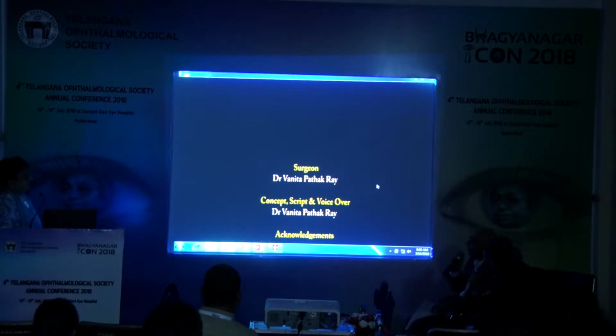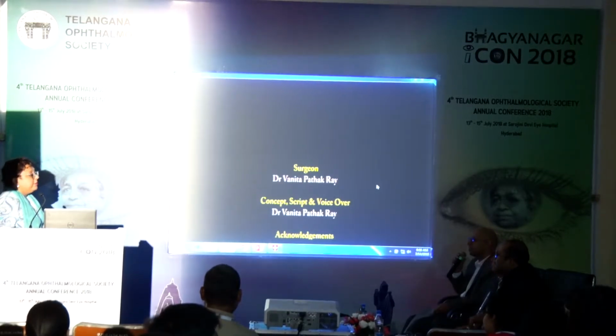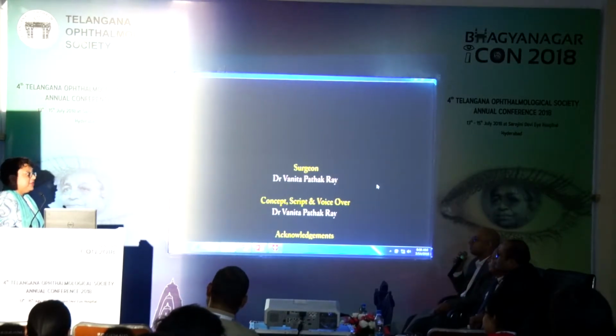That is a very nice video. Has this been reported before? The use of a vitrector through a PI for malignant glaucoma? Well, it is not unreported, but after recurrent aqueous misdirection, no.